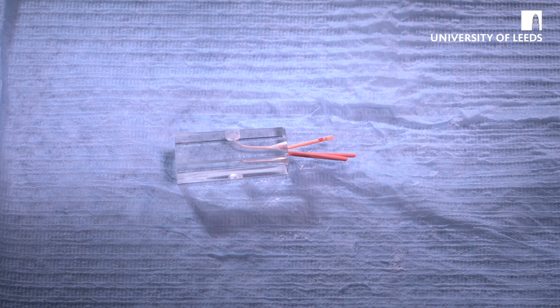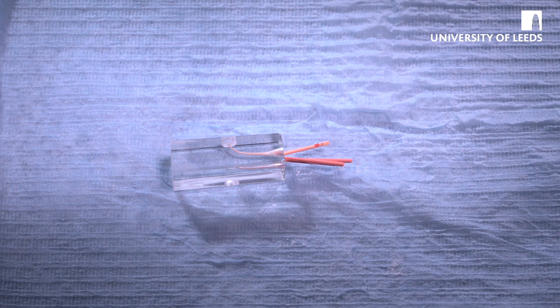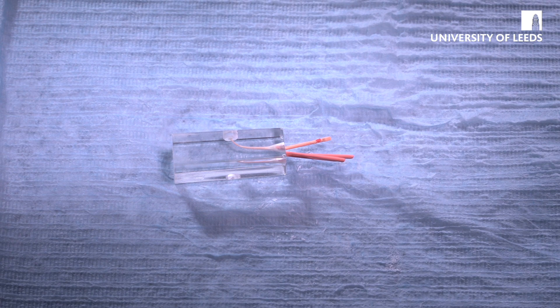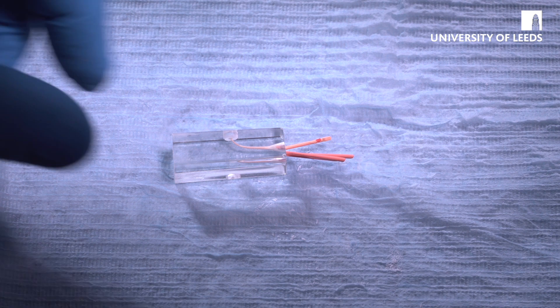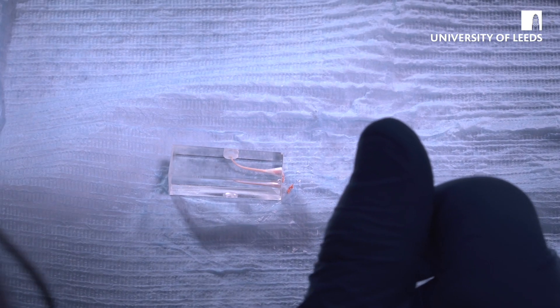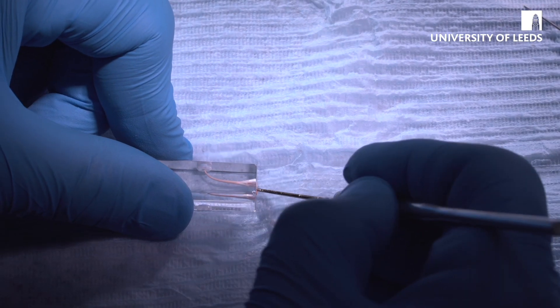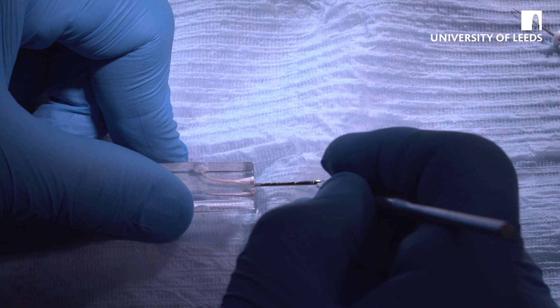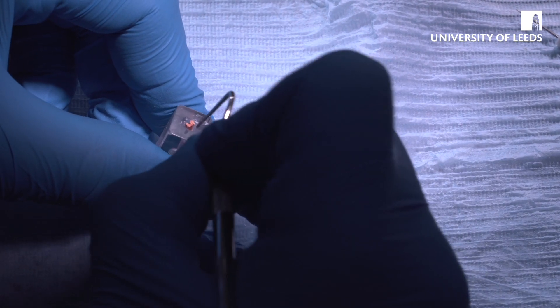Now you have to sear off the excess gutta-percha. There are a variety of ways you can do this — most commonly using a heated instrument, so use the safe heat device and a spoon excavator. Heat the tip up and then sear off at orifice level like so. Then get the plugger, and as the GP is still soft, just plug in at the top. That will leave you space to put a small amount of restorative material to lock it into place — and that's the demonstration completed.